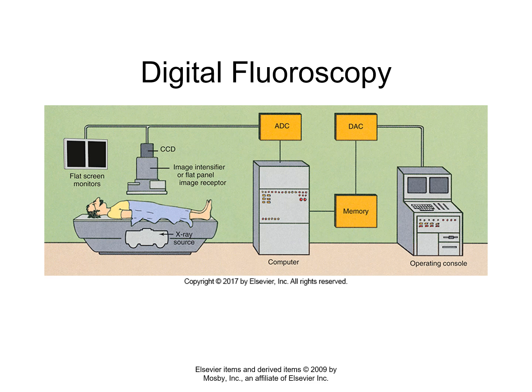Okay? And so that's very handy. We have light coming out of the output phosphor. If we glue fiber optic cable and cover the surface of the output phosphor with fiber optic cable, and then we bundle these fiber optic cables and glue the other end to the CCD, then all of the light coming out of the output phosphor will be trapped in the fiber optic cables and will deposit onto the face of the CCD. And so we won't have any loss of the information. None of the light will drift away in a random direction. So it improves the efficiency of the transfer too.